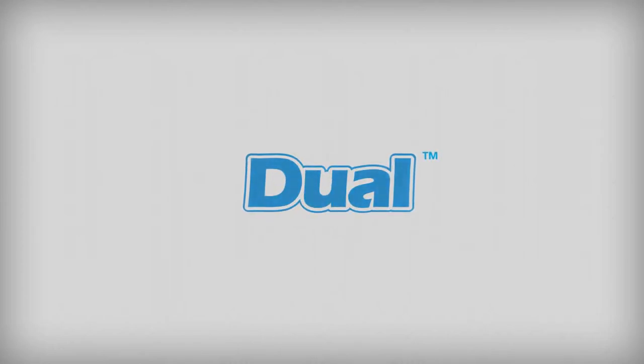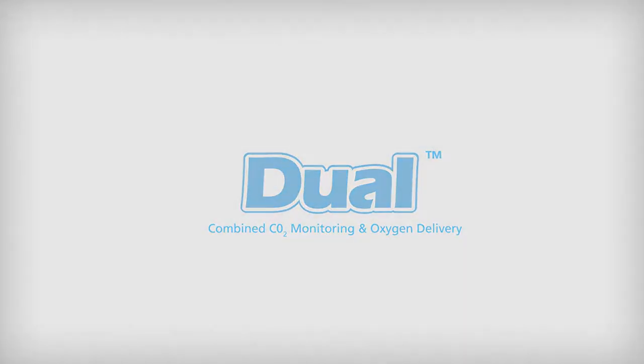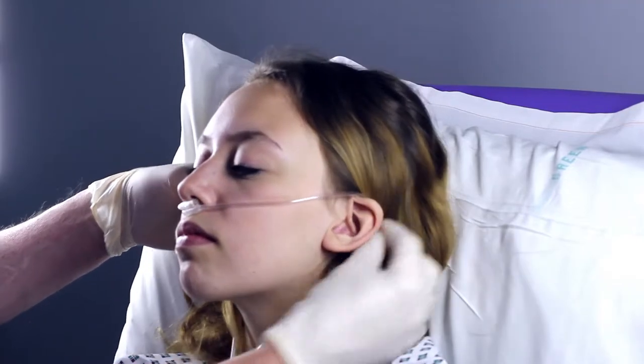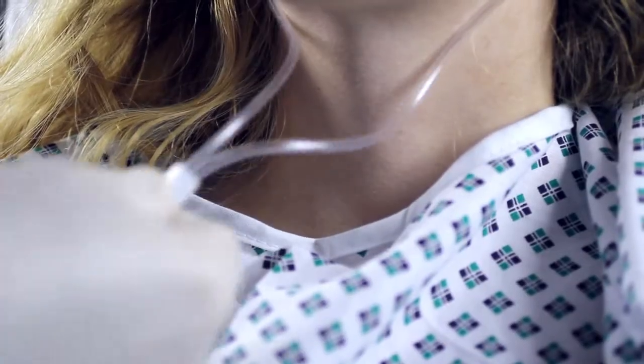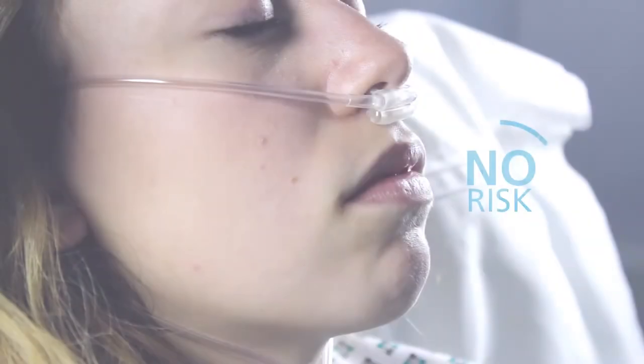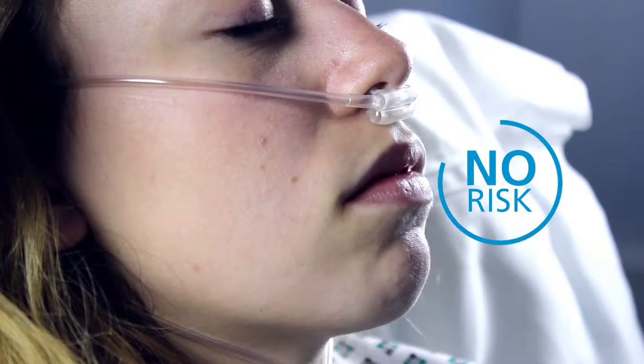The dual nasal cannula is designed to provide oxygen to both nostrils and also sample CO2 at the same time. The CO2 sampling is taken from both nostrils, and there is no risk of mixing with fresh oxygen, as the patient's expiratory flow will divert fresh gas away from the sampling prongs.